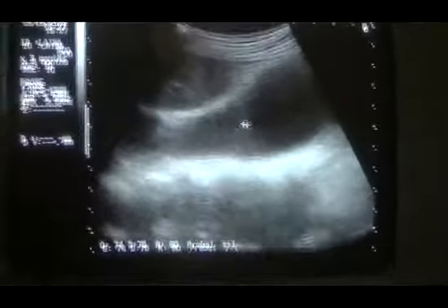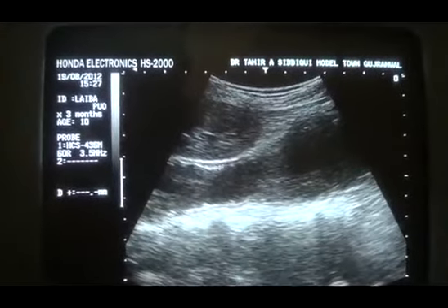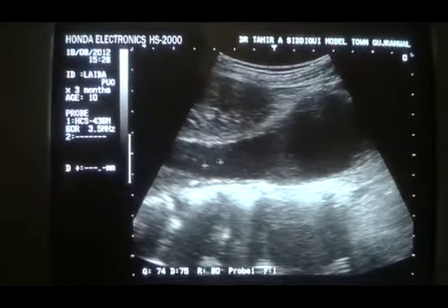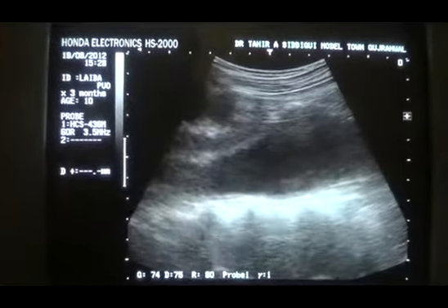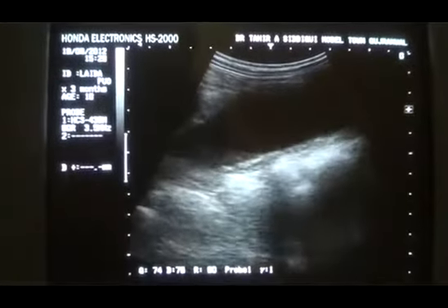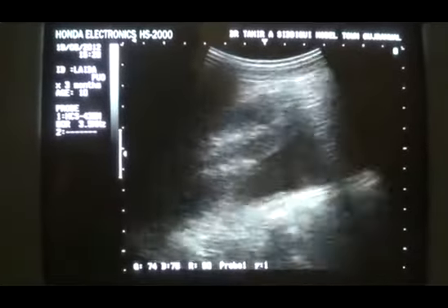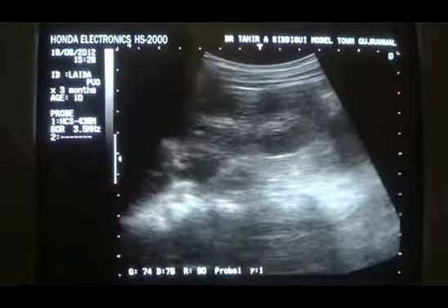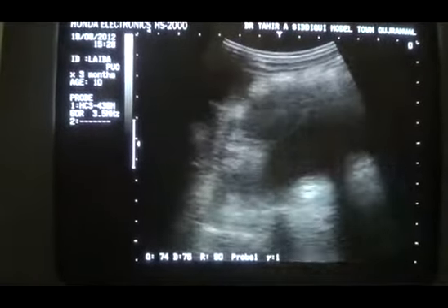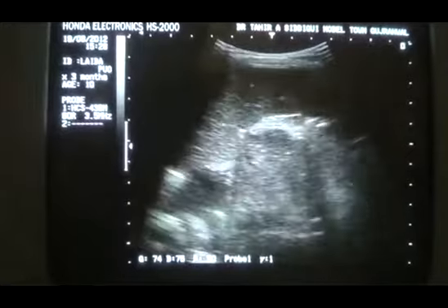Now it's clear, having echogenicities at the margins, with the major portion being clear internally because of the sterility produced by a lot of antibiotics used by this young girl for the last 3 months. So this is a study of PUO.